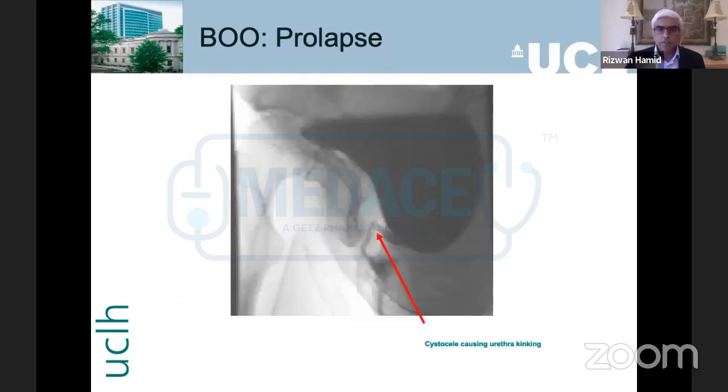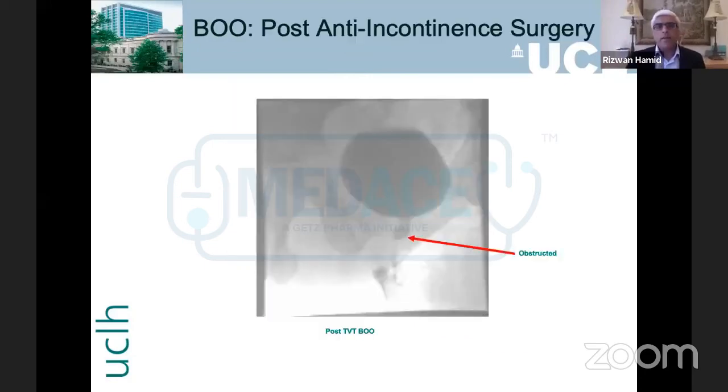What's happening here? Dr. Raheela showed a very nice case of prolapse. This is what is happening. A cystocele is kinking. That was a different prolapse, by the way. But this is a cystocele which is kinking. So the patient might present with obstructive symptoms, hence the importance of clinical examination. And here you can see that she has got kinking. So here can be a situation where she's got stress incontinence, but voiding dysfunction. If you do the urodynamics, this is what you find out on the video clip, and then you can treat her appropriately.